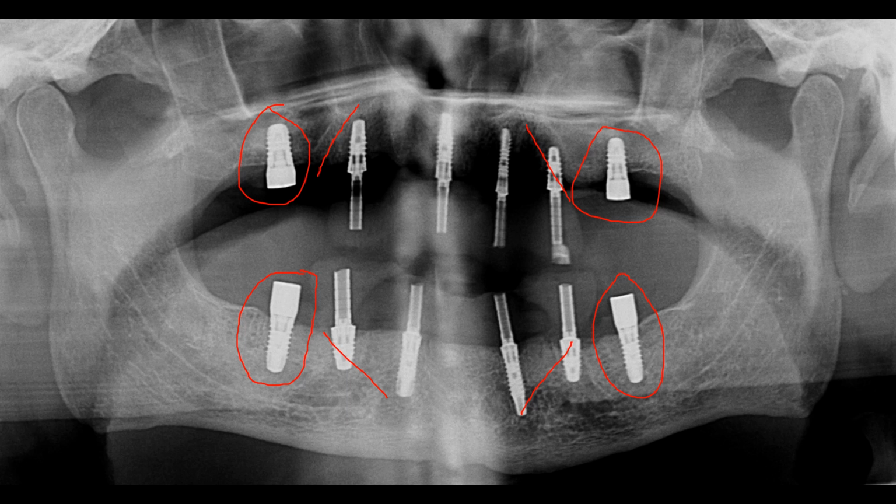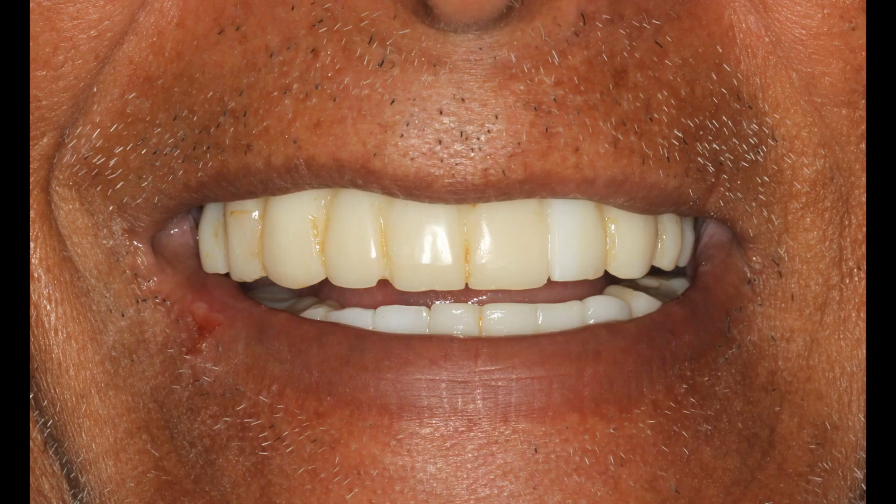So even though it protracts treatment and increases the cost slightly, I believe that supporting the implant bridge all the way around is of paramount importance. And even though the temporaries were not the prettiest ones I've ever made, with the lips retracted, they were quite aesthetic when he simply smiled and spoke. This is after a number of different breakages and repairs, but they were hanging in there and they made it through the 9 months that they needed to be in his mouth.